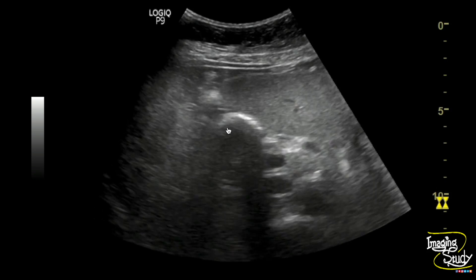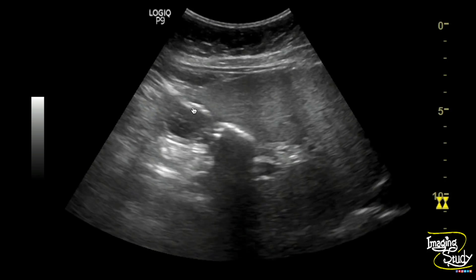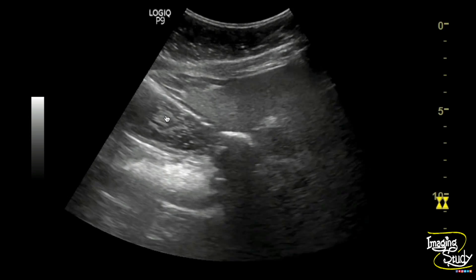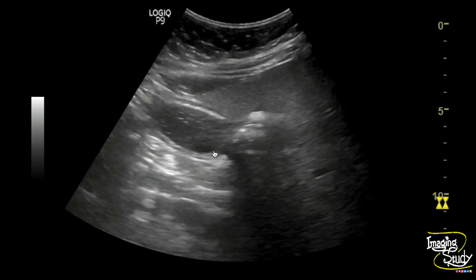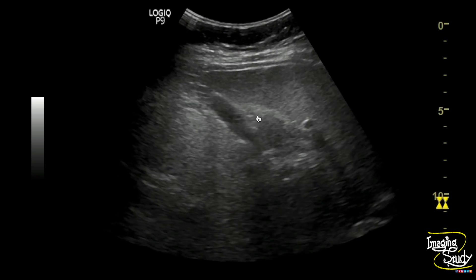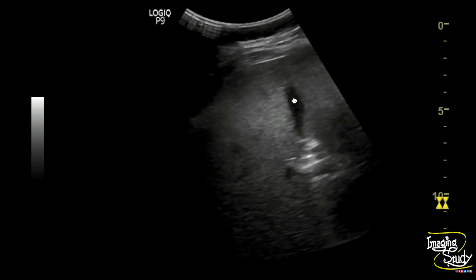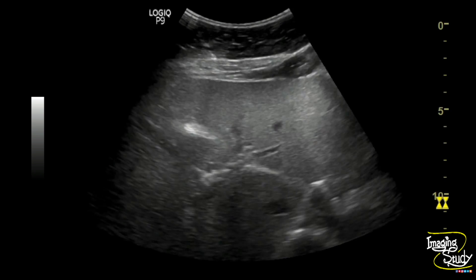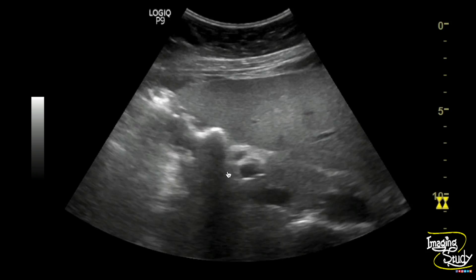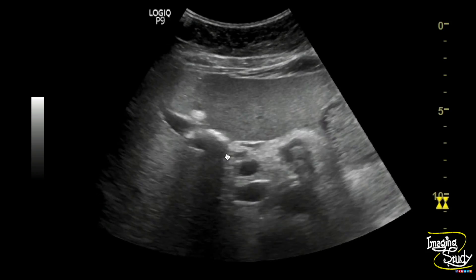Now let's check the video. Here you can see the hyperechoic structure casting a post-acoustic shadow noted at the gallbladder fossa. You can see this is actually not the gallbladder — this is the duodenum with internal fluid and air droplets. Now you can see the actual gallbladder. This is a slightly contracted gallbladder as the patient is in a postprandial state, and you can see the lumen is completely clear of any hyperechoic structure. So the hyperechoic structure you saw before is duodenal air.